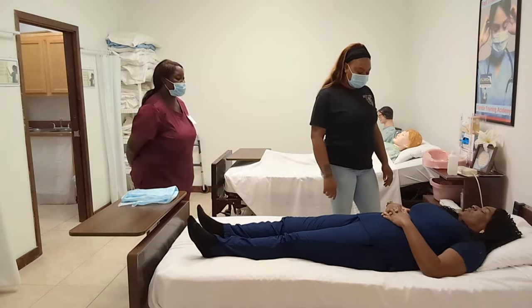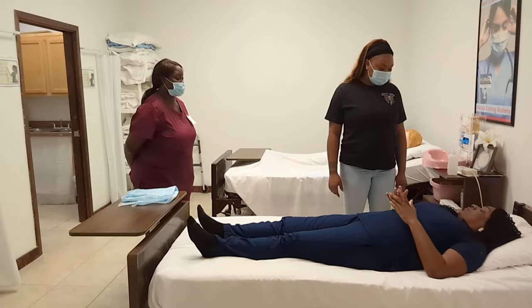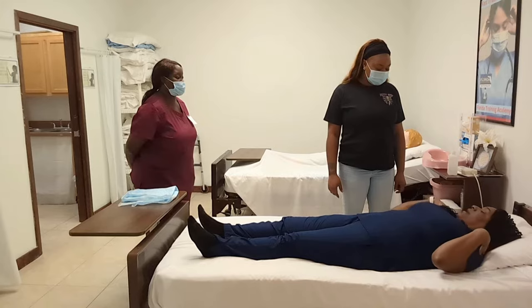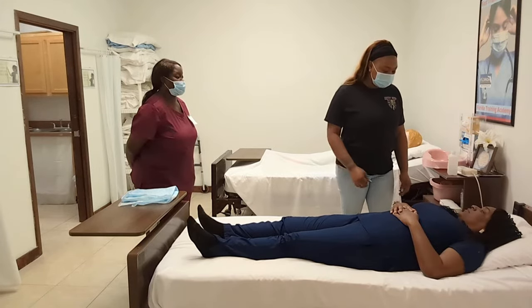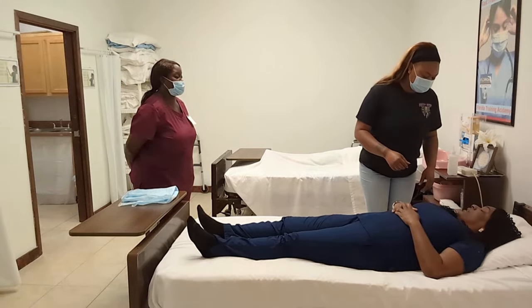I'm just showing you how to maneuver someone who cannot lift their hips. I'm in the center of the bed. If you turn me now, I'm going to fall off the bed. So if you'll gather or lift both of my shoulders, and don't touch the bed while you're doing it. Your hands can touch, but your legs can't.